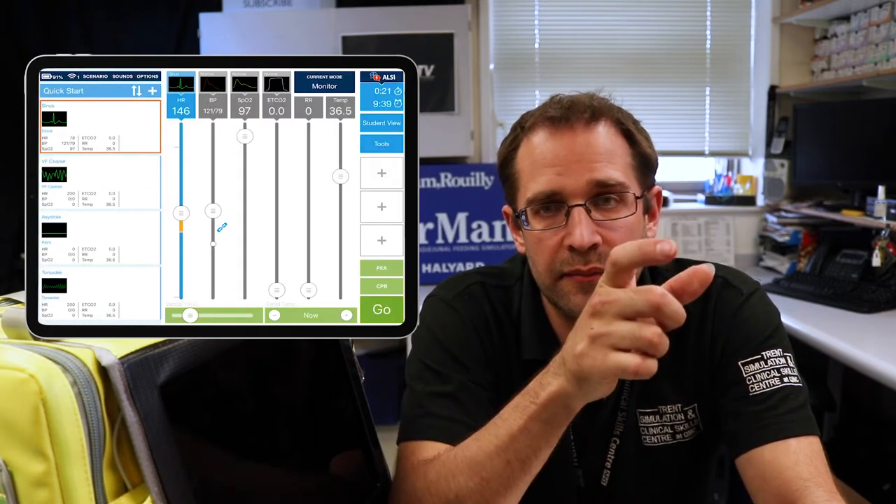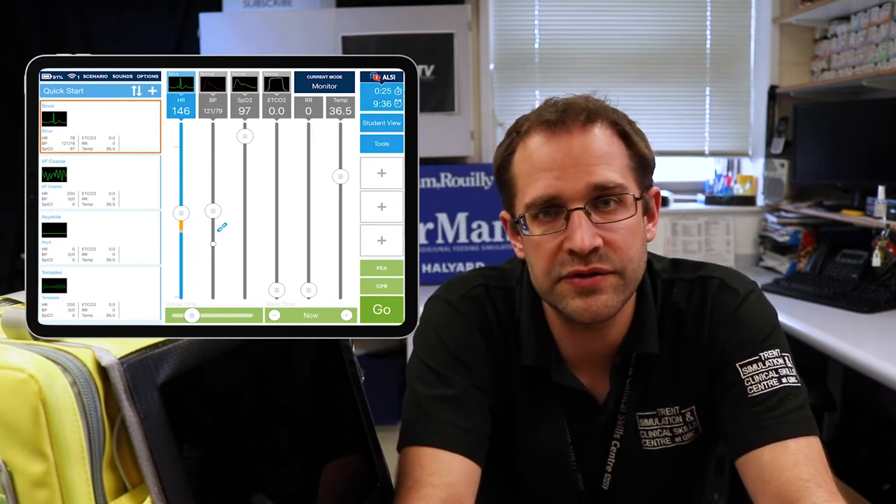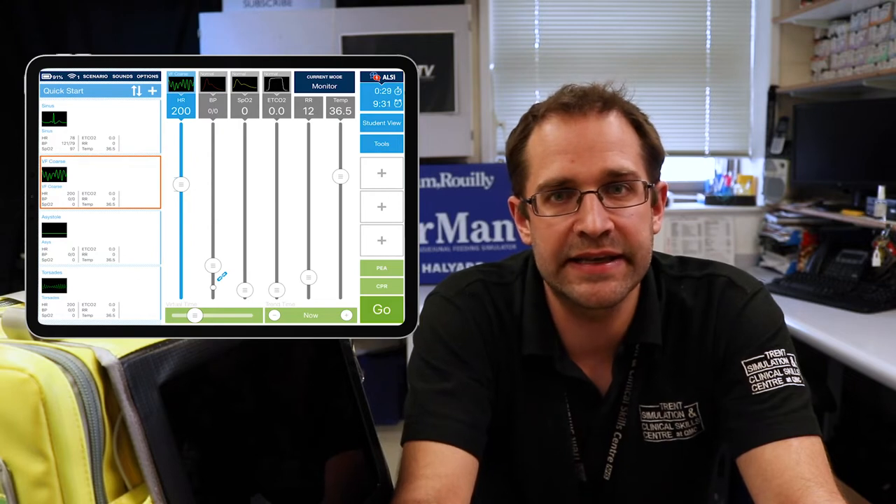You also have a few quick-jump buttons on the side which you can programme yourself, allowing you to quickly jump into AF, asystole, or back into sinus rhythm if needed. Or you can do it over a set period of time so it happens progressively. These can all be reported and logged if you want to use them for assessments. It's completely independent of any mannequin — it can be used with a real-life actor or a mannequin. If using it with a high-fidelity mannequin, just be aware you'll need to marry the two sets of readings up. You can also use it with a low-fidelity mannequin to give it monitoring it wouldn't normally have.